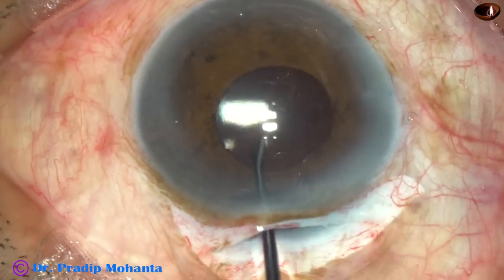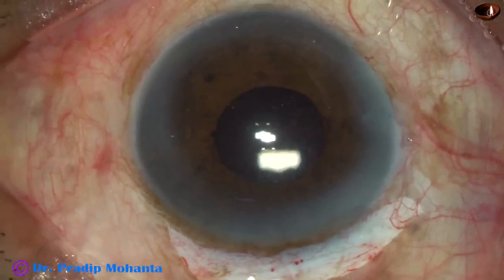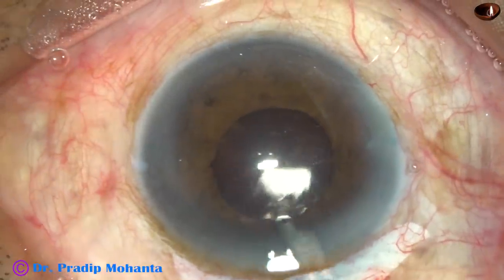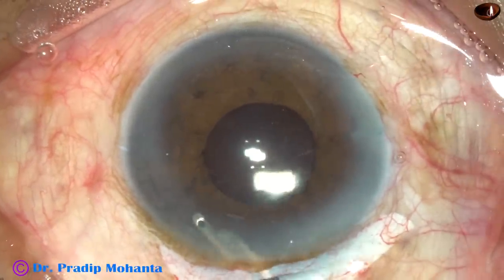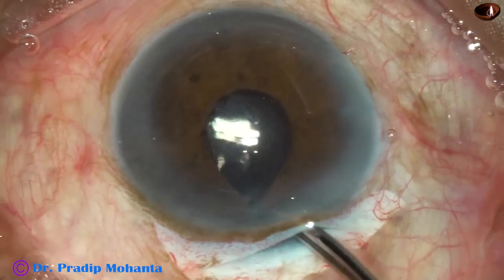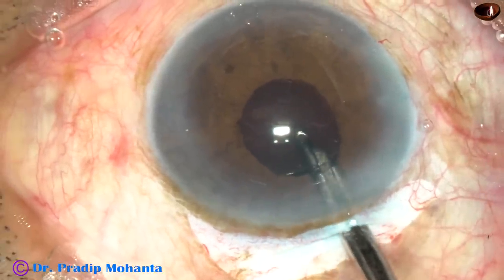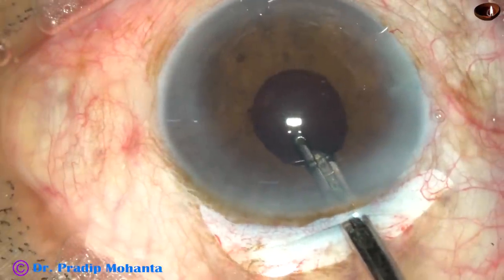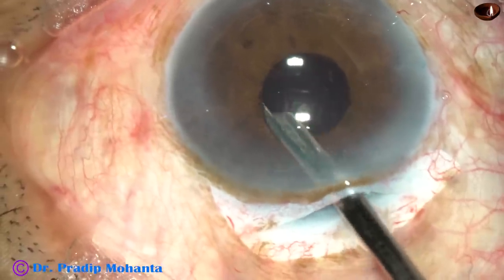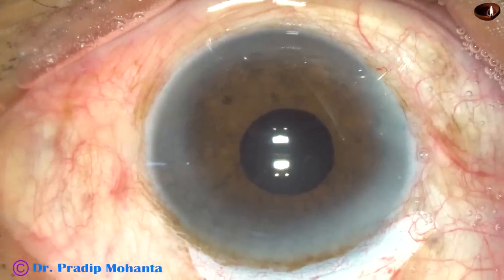Now we have to remove the visco used for implantation of the intraocular lens. This step is very important — if you don't remove the visco thoroughly, there can be visco-induced raised intraocular pressure. Remove visco from the anterior chamber as well as go behind the IOL and remove visco from the capsular bag. You may not be able to do this alone, so ask your mentor to help you with this step.